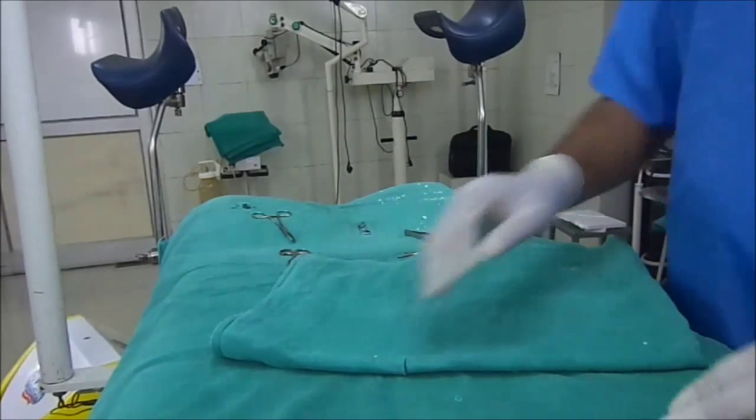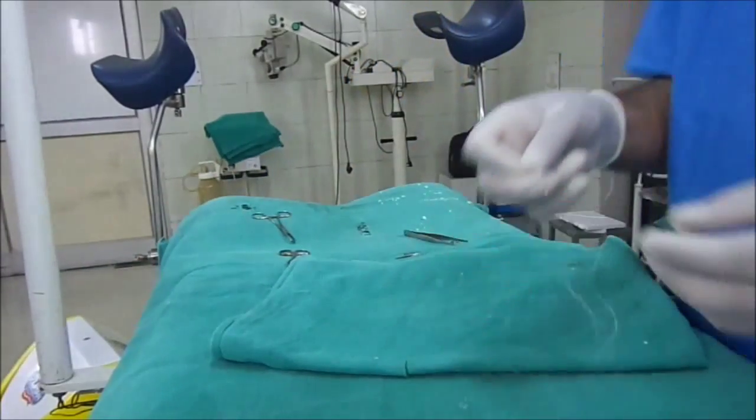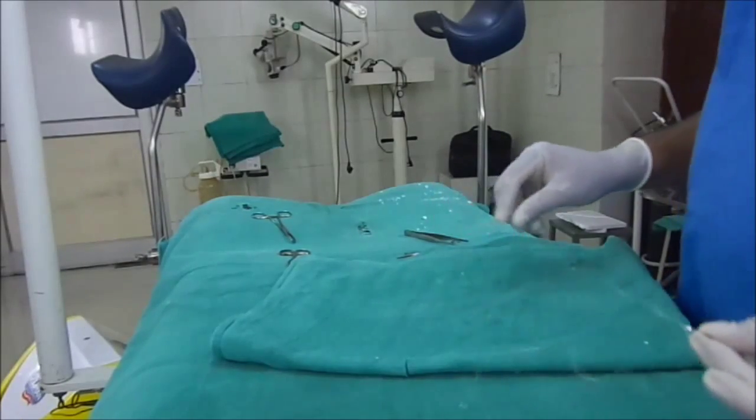Hi friends, I am going to demonstrate to you the suturing techniques — how to perform the surgical suturing.